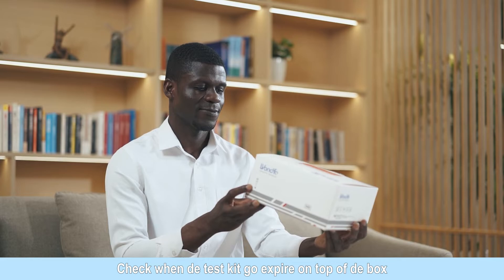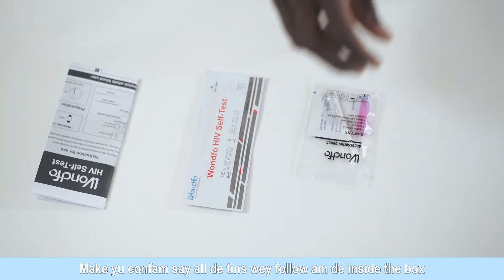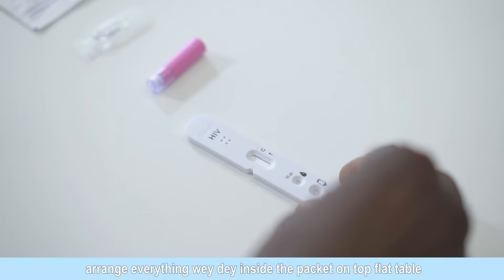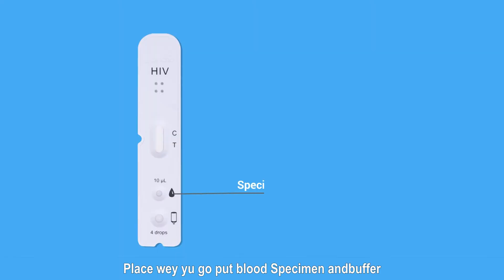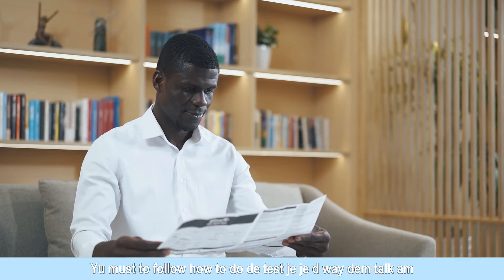Check the expiration date on the box. Make sure the components are all in the box. Open the test cassette pouch just prior to use. Put all parts of the test kit on a flat table. There are specimen well, buffer well, and result window on the cassette. You must follow the test procedure carefully to get an accurate result.